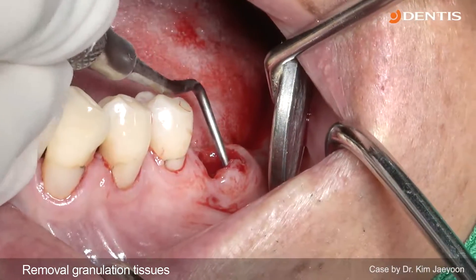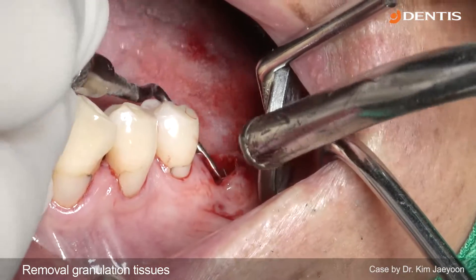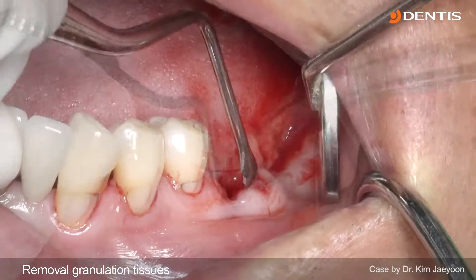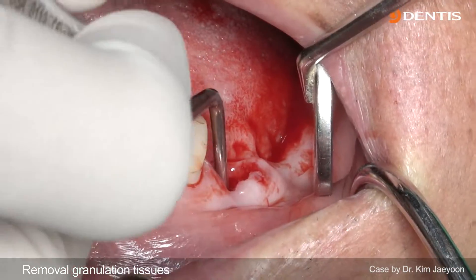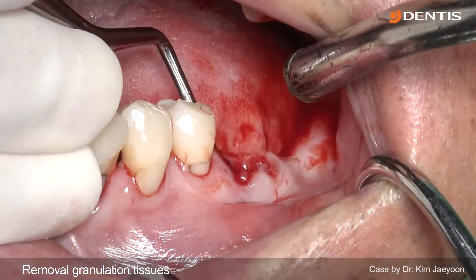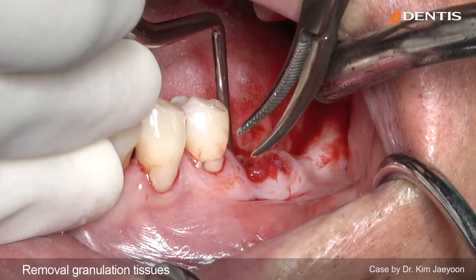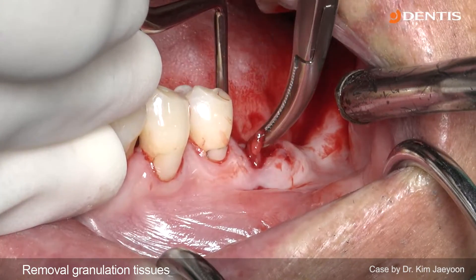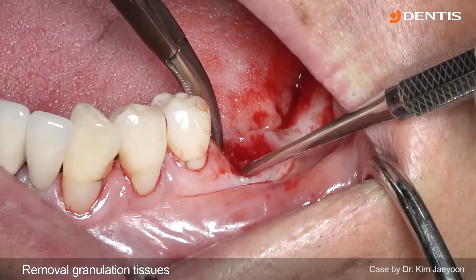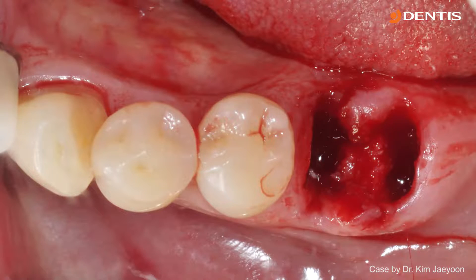There is a lot of granulation tissue and bone destruction on the mesial side. So I remove the granulation tissue with a surgical curette, gently removing it with saline irrigation.